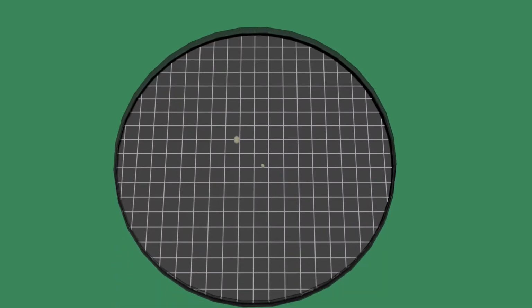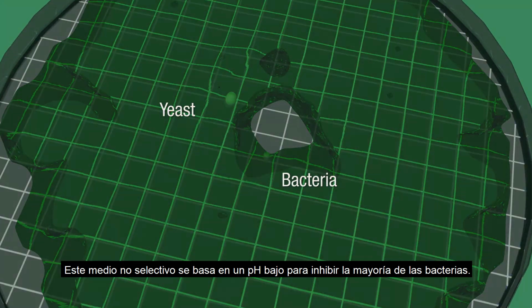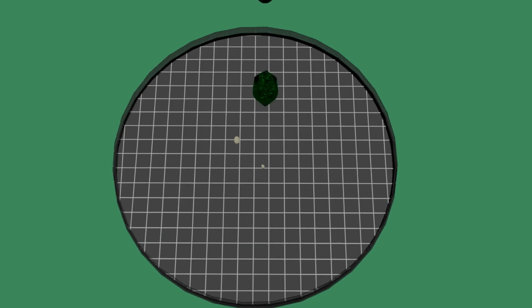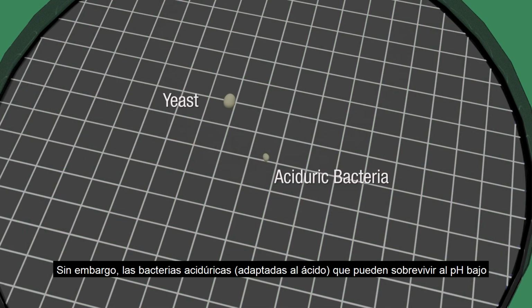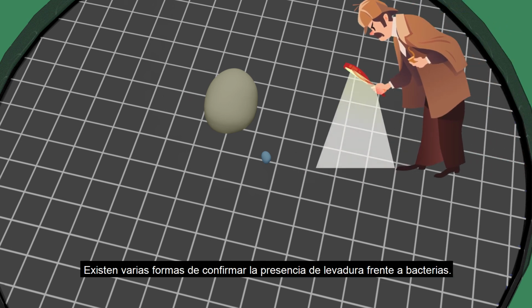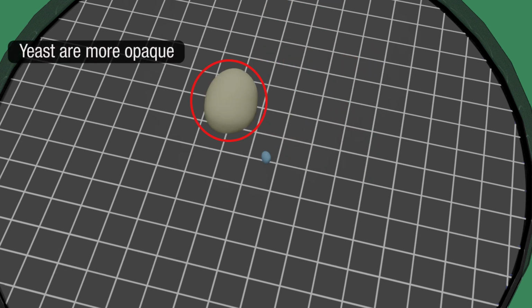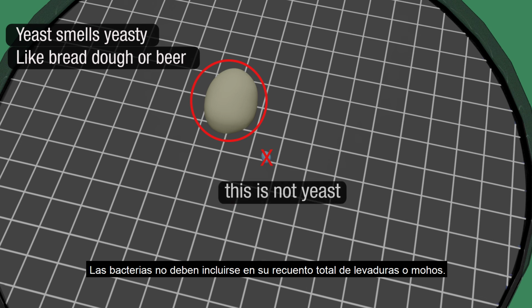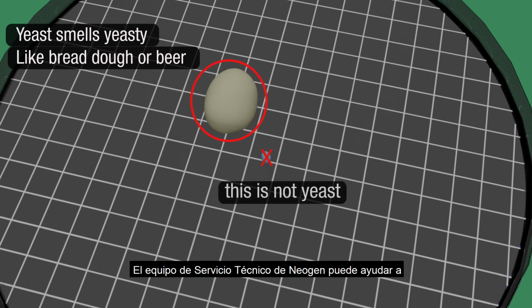This non-selective medium relies on low pH to inhibit most bacteria. However, aciduric, acid-adapted bacteria that may be able to survive on the low pH can develop from frequent exposure to acidic environments. There are several ways to confirm the presence of yeast versus bacteria. Bacteria should not be included in your total yeast and mold count. Neogen's technical service team can help answer questions regarding this determination.